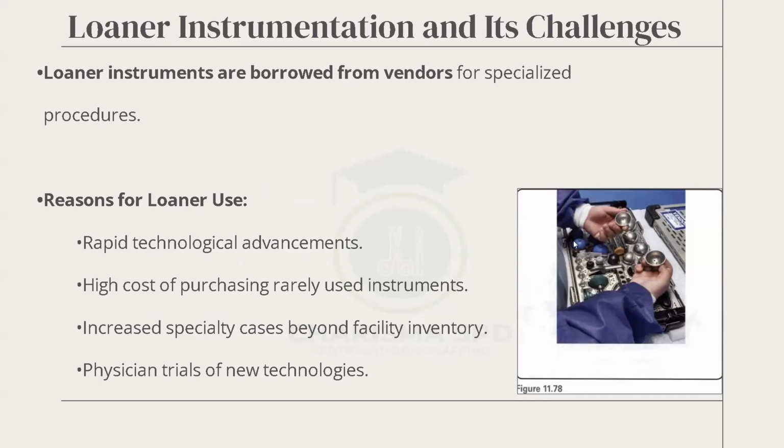Yes, loaners. We said loaners are instruments that we do not have as a hospital or a facility. So we need it for a procedure, and we go to a third party or a manufacturer and take. All loaners are borrowed and we pay a loaner fee. It can be a camera, it can be a scope, it can be a rigid instrument like the one in the picture here. Okay. Because of the cost involved, we are not able to buy it, so we go and borrow. And maybe they are not doing such procedures every day. So when we need it, we go and borrow.